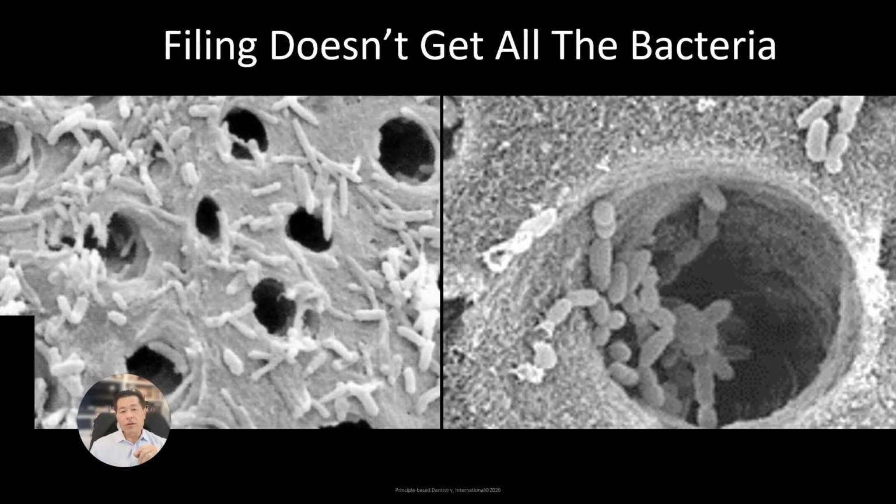Now, if that's our protocol, when I go back in with the indicator and I rinse out the canals with sterile water and then I withdraw some of that sterile water, I should be able to test it and get a low score because we've basically removed all the bioburden. We've dissolved all the tissue, we've gotten rid of all the bacteria in there, and if we've gone down to working length, hopefully we don't have any purulence or bleeding down there. But now we've got a nice clean canal, and that's what we're striving for.